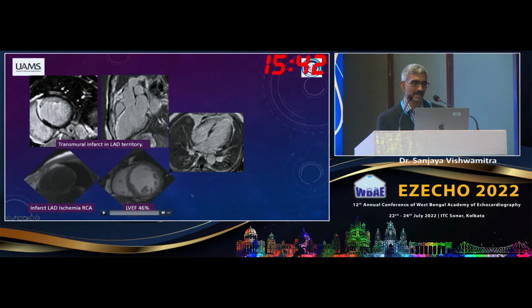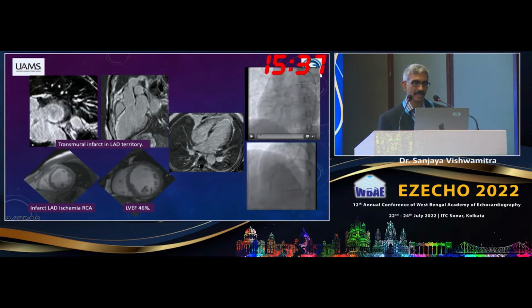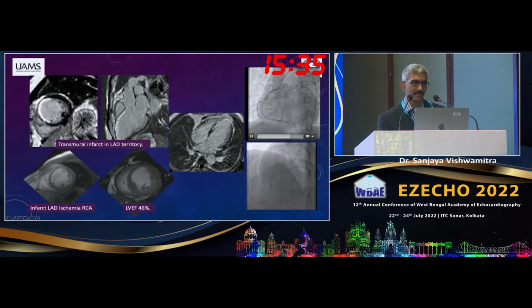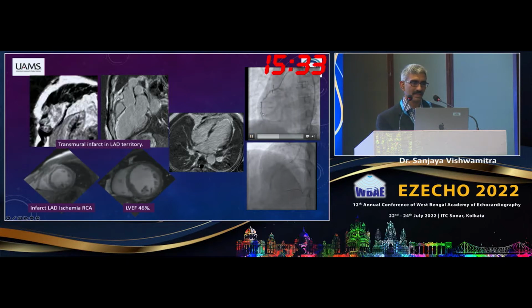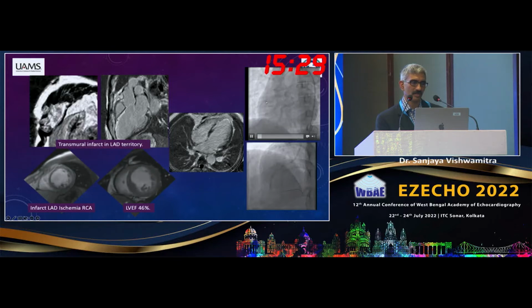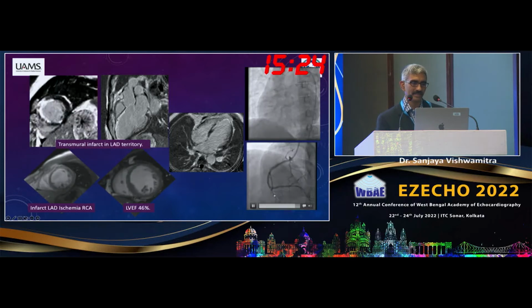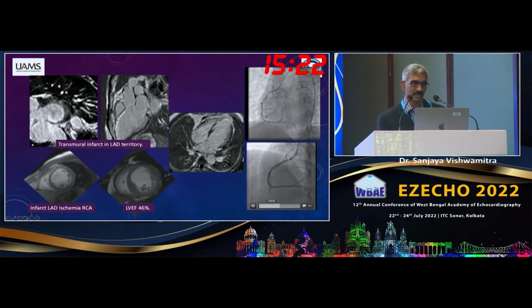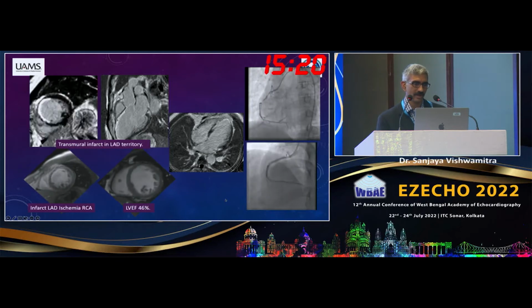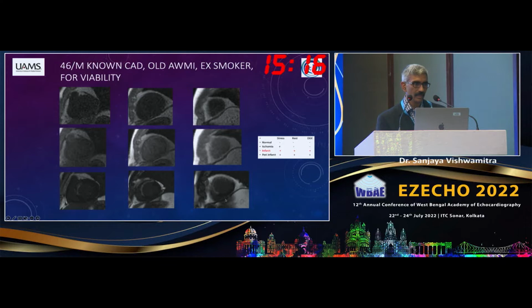The patient had an LVEF of 46%, went on to get a coronary catheter angiography exam, and you can see here that the patient has diffuse disease, at least proximal disease in the right coronary artery in 2 different locations, then had a PTCA to improve his viability in the RCA territory.